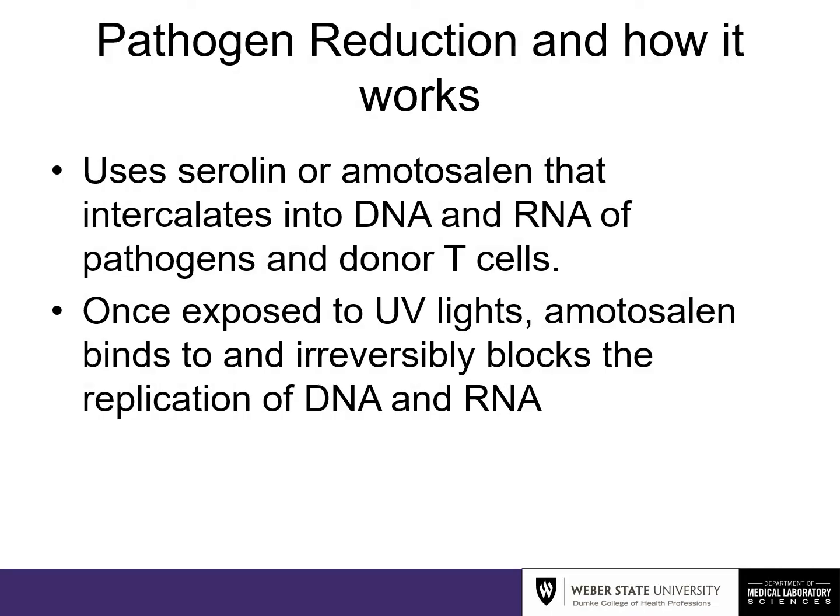So how it works. Basically, it uses amotosalen, which intercalates into the DNA and RNA of pathogens and donor T cells. Once exposed to UV light, amotosalen binds and irreversibly blocks the replication of DNA and RNA.